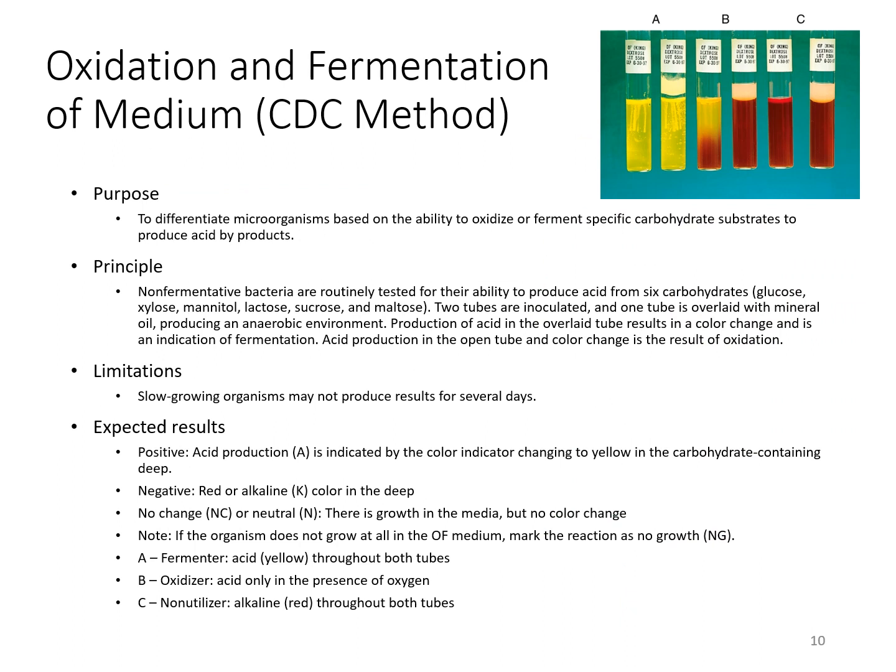With your oxidation and fermentation, what you're looking for is to see if these organisms are able to either oxidize or ferment different carbohydrate substances. Depending on which one you're looking for, you would use that particular carbohydrate. So for example, we've mentioned with some of our non-Enterobacteriaceae, their ability to ferment glucose. Of course, most of your Enterobacteriaceae do ferment glucose.